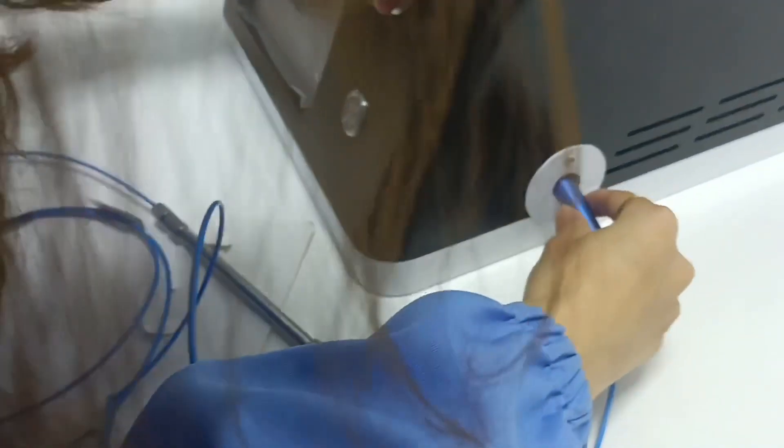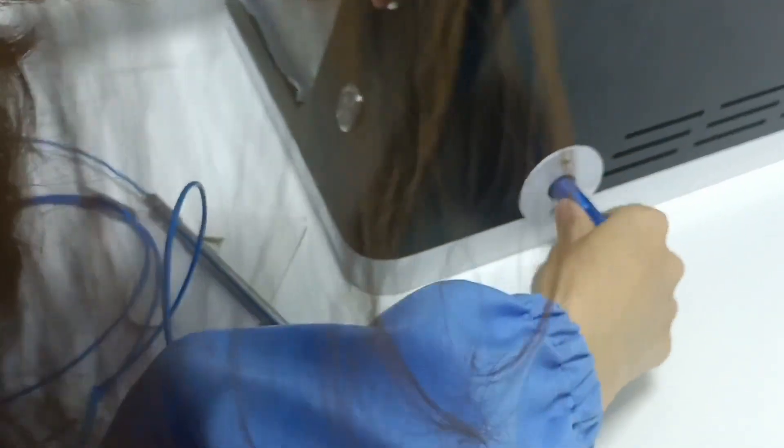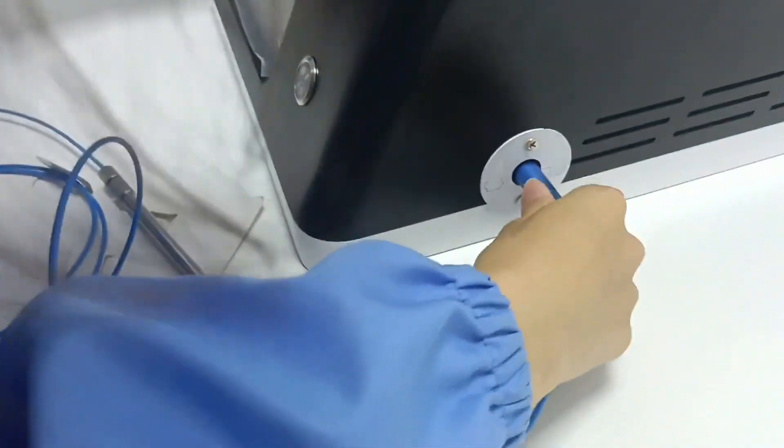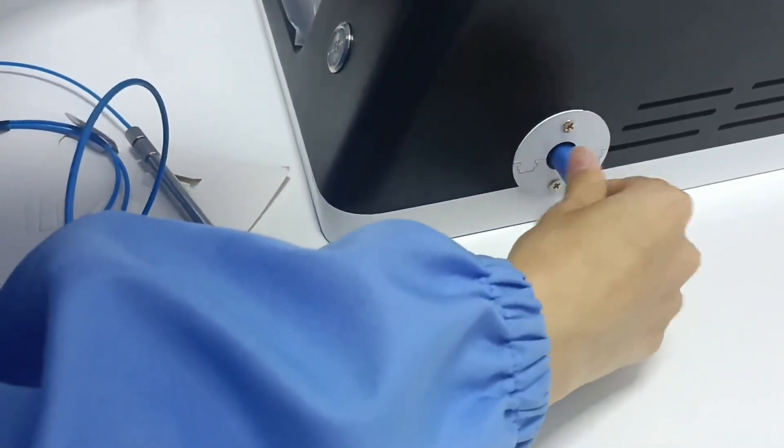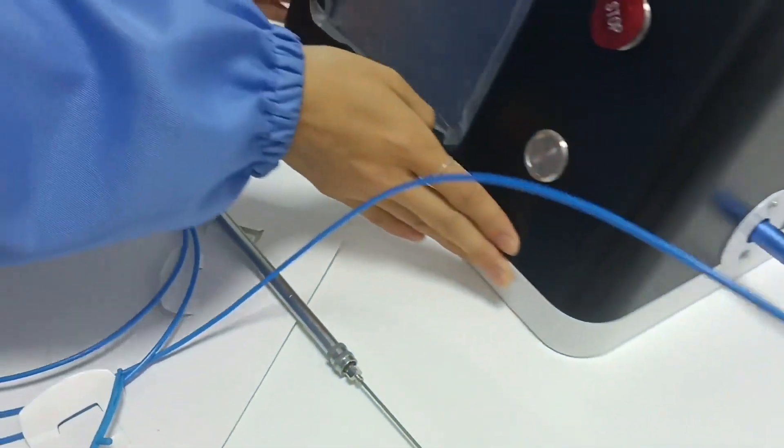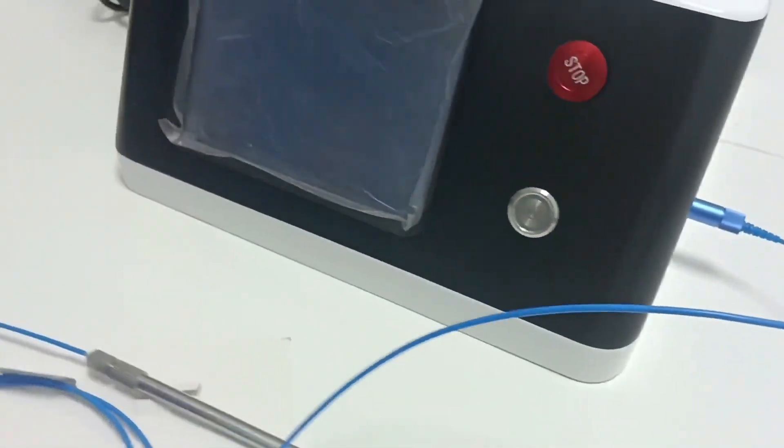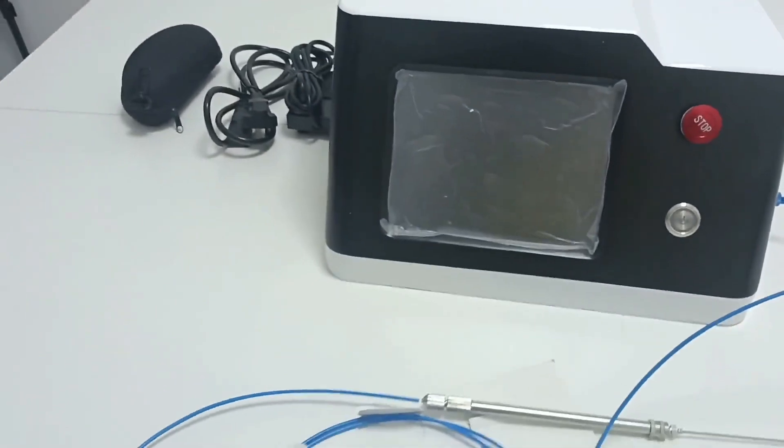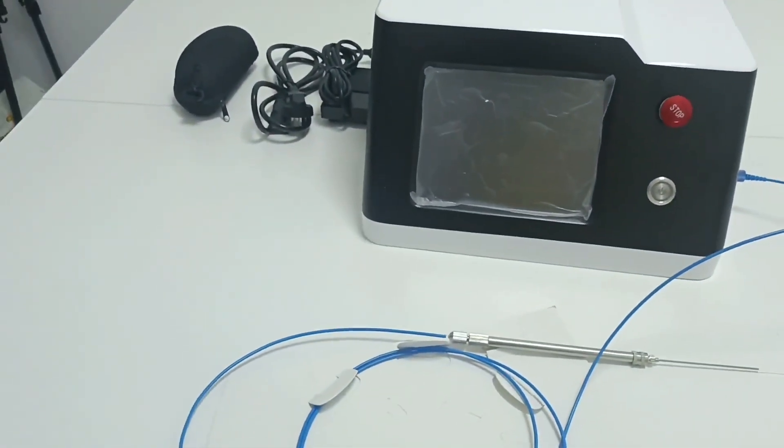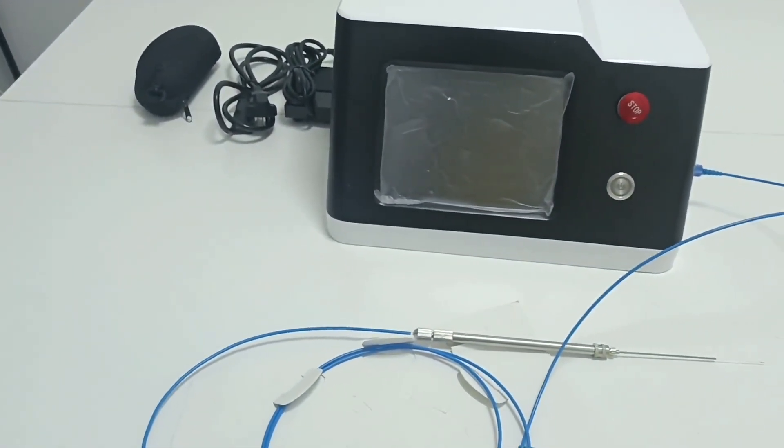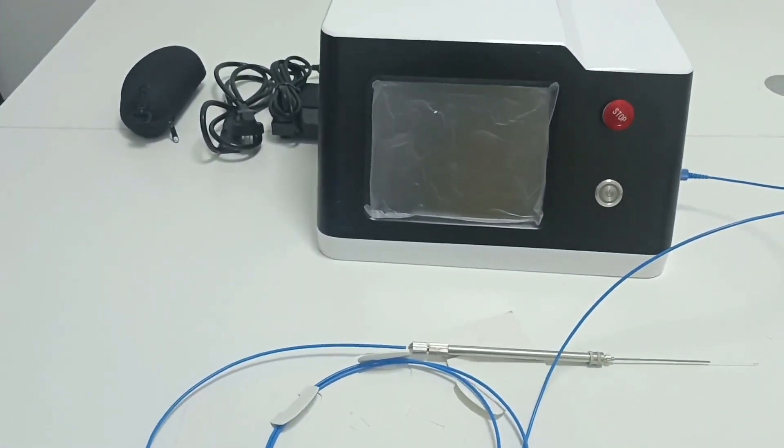3. Gently unscrew the optical fiber protective cap of the optical fiber port and the optical fiber output port of the instrument. Insert the optical fiber end into the optical fiber output port of the instrument. Be sure to tighten it, but do not use too much force. Do not touch the laser output port and the optical fiber port during connection.